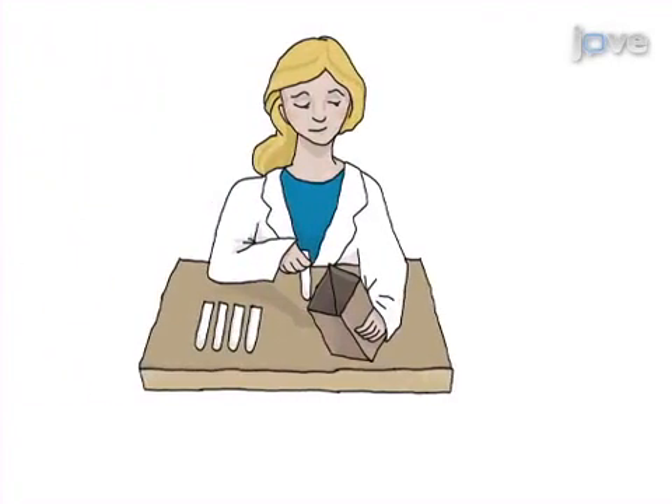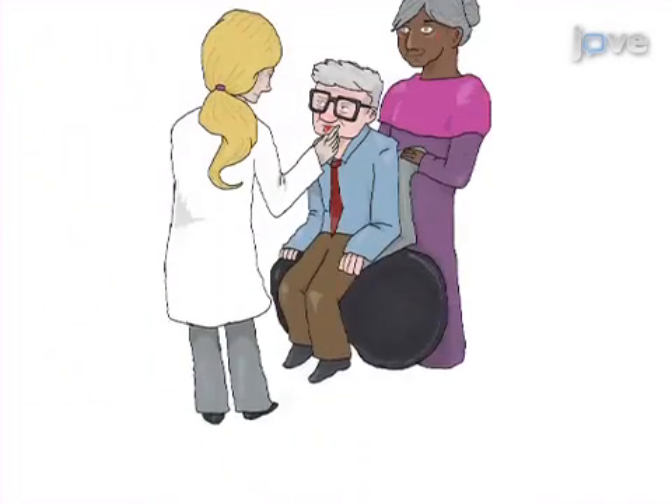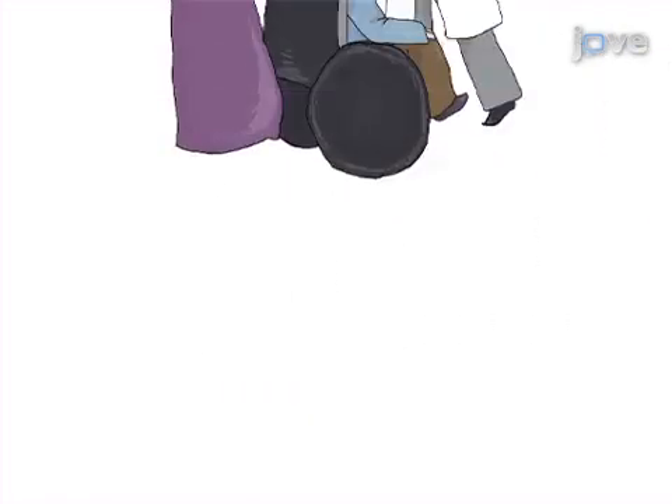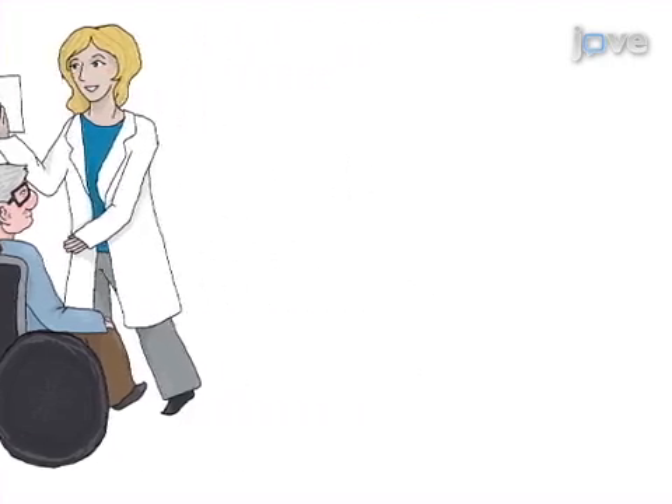This is accomplished by first assembling the necessary saliva collection supplies. The second step is to arrange for the home visit to provide the supplies and demonstrate the saliva collection procedures to the caregiver. Next, provide written instructions and answer any questions. The final step is to return the saliva samples to the lab and conduct the assay procedures.